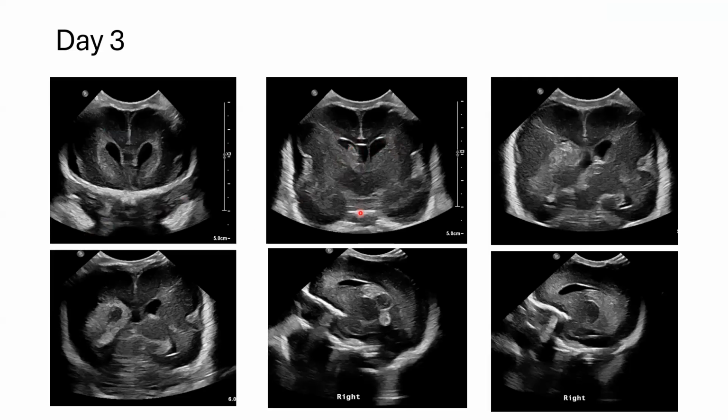The pointer? Okay, brilliant. So this image is the first image where we are looking at the frontal sections in the coronal view. And this is the right side. And you can see that the lateral horn, you can already see that there is a little bit of blood there. There is some periventricular brightness in the previous image.